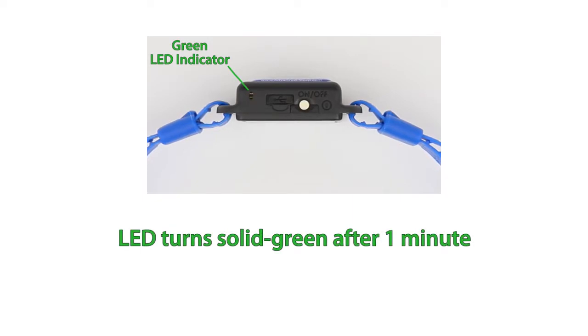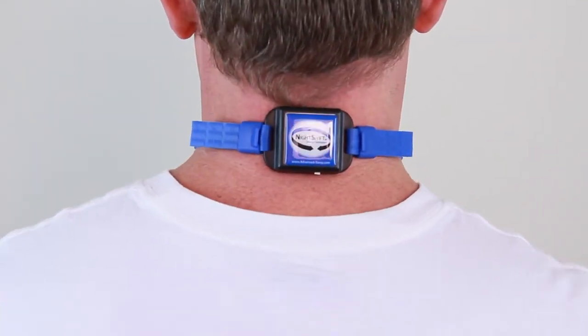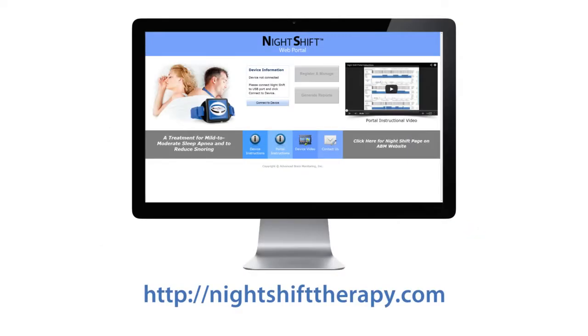After the first minute, the indicator light will change to steady green. If the indicator light is orange, the device must be recharged before use. You can now affix the Night Shift and go to sleep. Position feedback typically begins 15 minutes after it is turned on to provide you the opportunity to fall asleep on your back. This setting can be changed using the Night Shift portal.